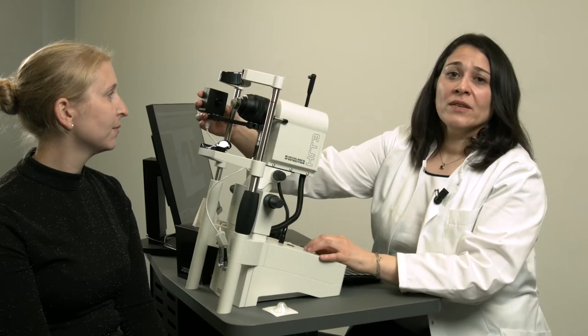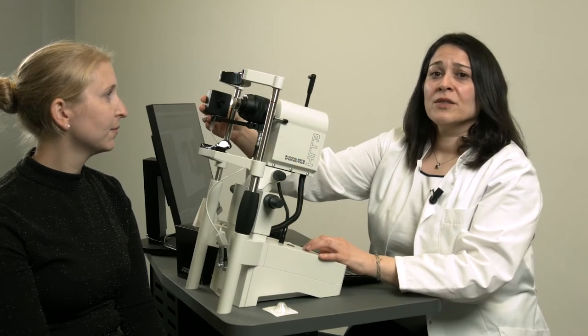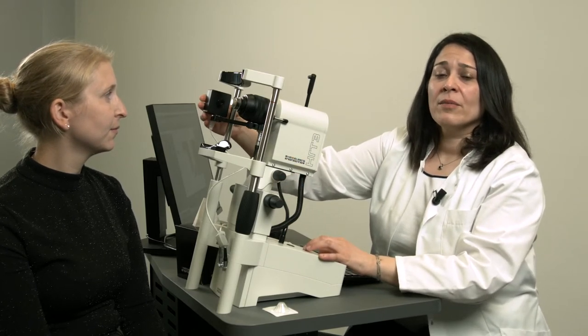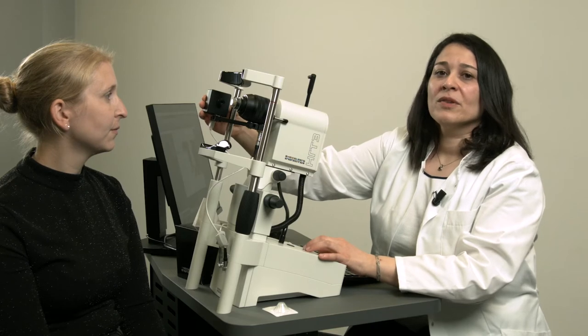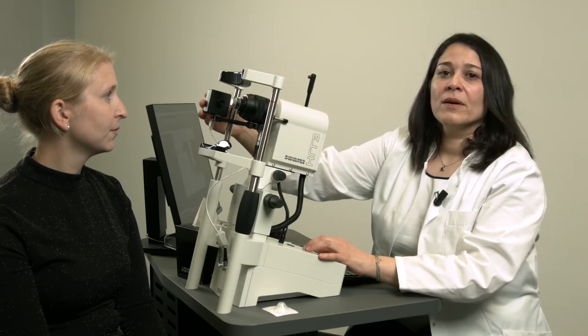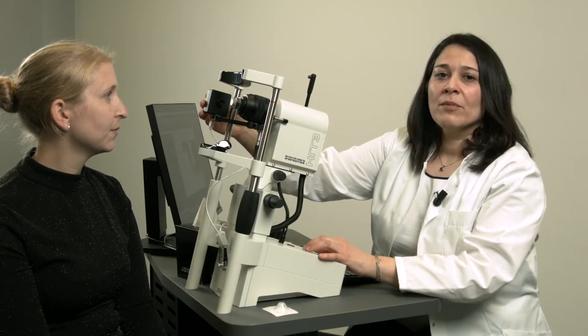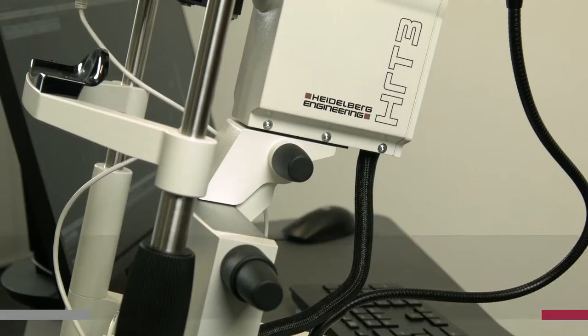Position the CCD camera so that the optical axis of the CCD camera is exactly perpendicular to the optical axis of the scanning laser camera. The camera must be located to the side of the eye to be examined.